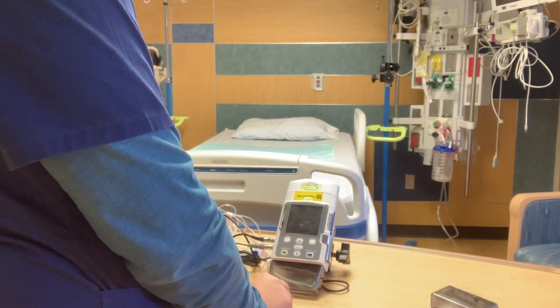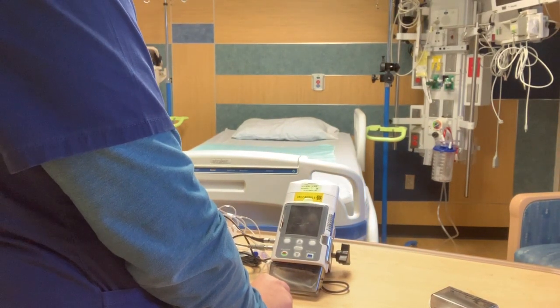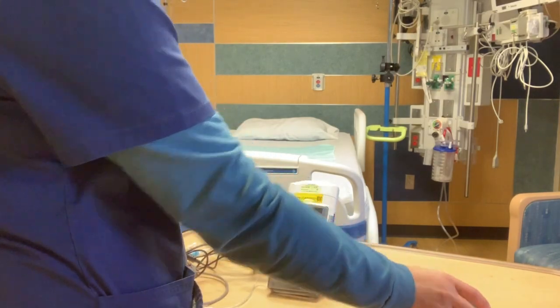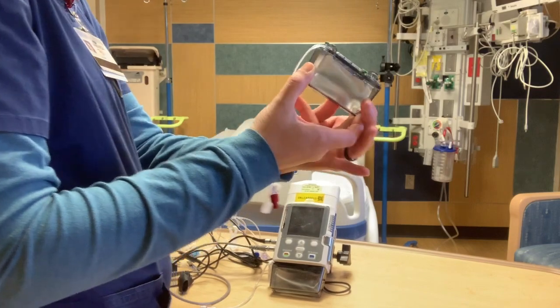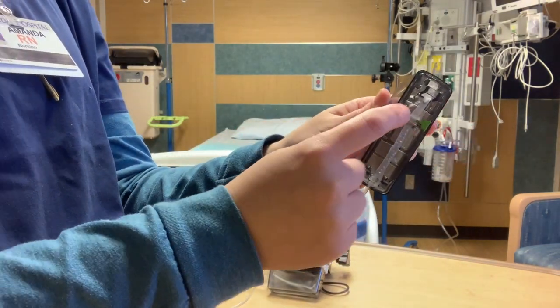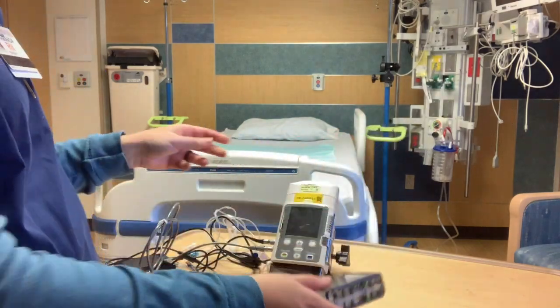This is the Skill Ambassador video for the PCA with the new CAD pump. Some of the different things you'll need — this is what the medication cartridges look like. They'll come filled from pharmacy and there will be a little green notch that you have to remove prior to installing this.